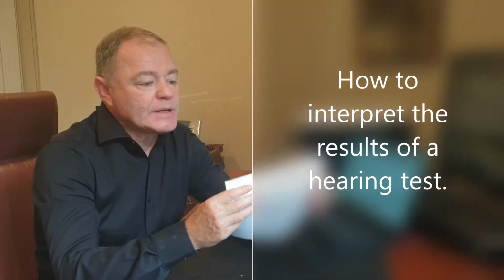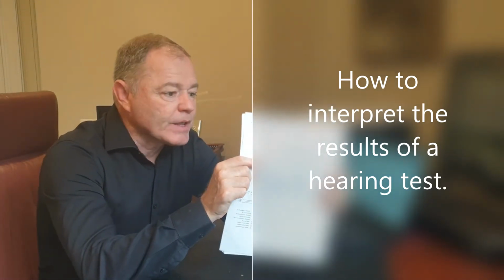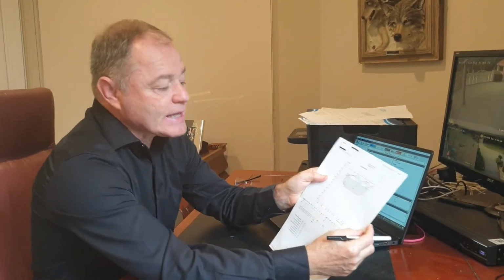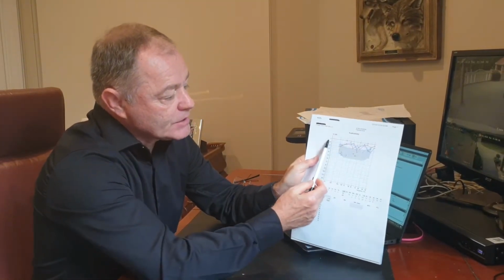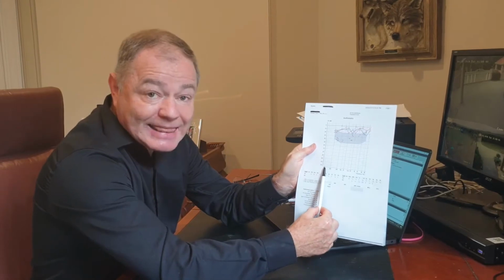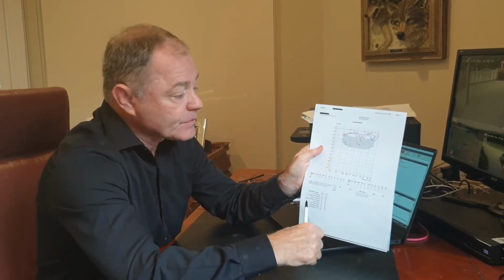And so you've probably seen a graph similar to this from your audiologist. So the graph itself is very simple, very easy to understand. So your hearing, if it was normal, would be a straight line across the top of the page at 0. That's where it ought to be. If your hearing gets all the way down to 120, that's when the hearing is all gone. That's when there's nothing left. So we'd say at that point, you're stone deaf.